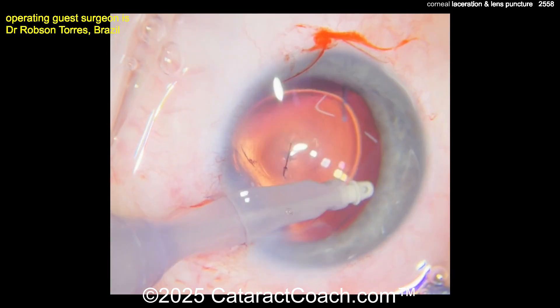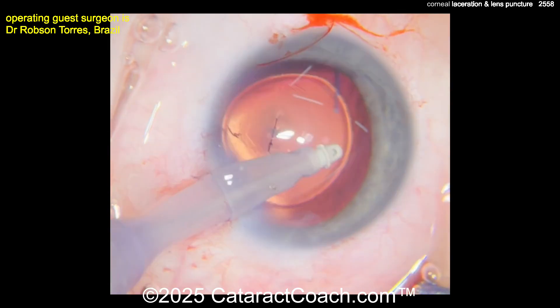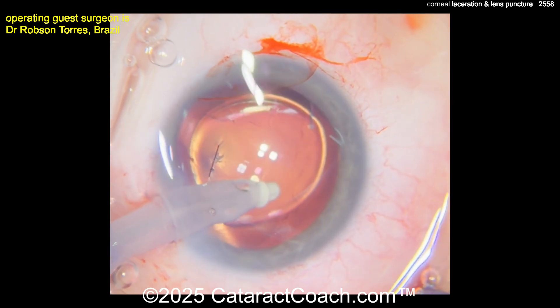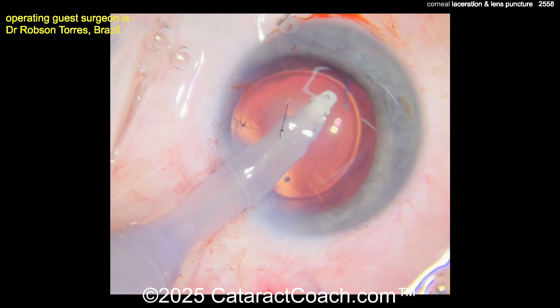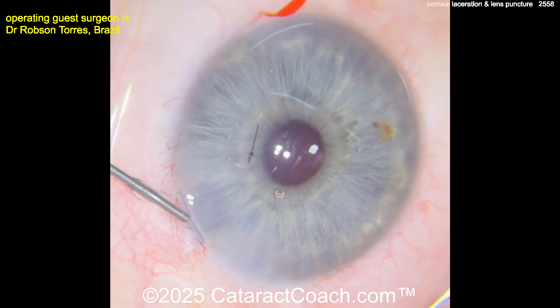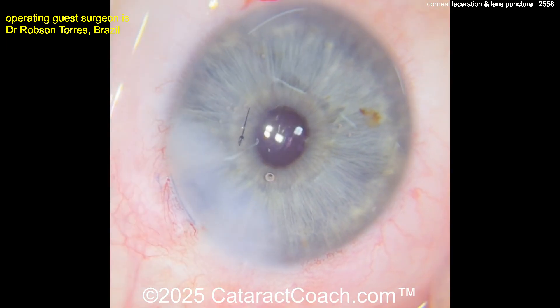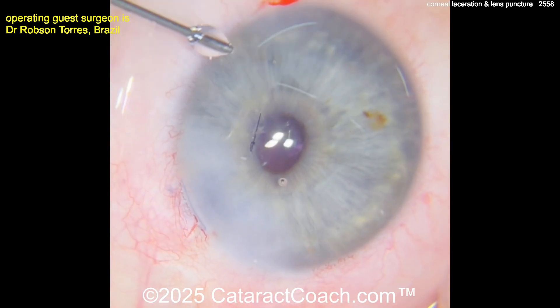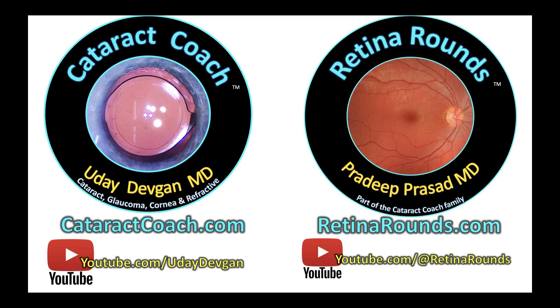This is a beautiful lens — looks fantastic, in great position and correctly oriented. I like how that suture has held up beautifully throughout the case with no leaking. Check everything at the end with fluorescein dye — do a Seidel test on the cornea to make sure it's absolutely watertight; if not, put in an extra suture. Those sutures will need to stay in the eye for quite a long time — at least a couple of months. Beautiful result — I hope the patient learned the lesson and starts wearing safety glasses. Check out our sister channel retinarounds.com!